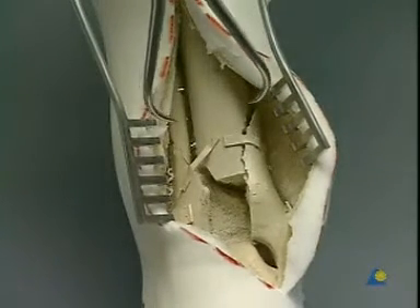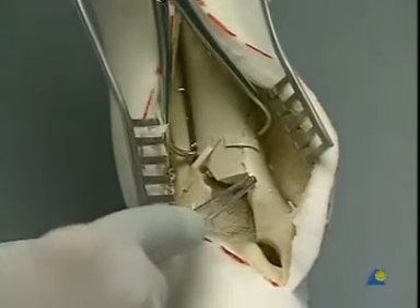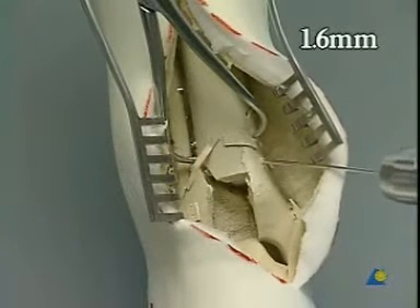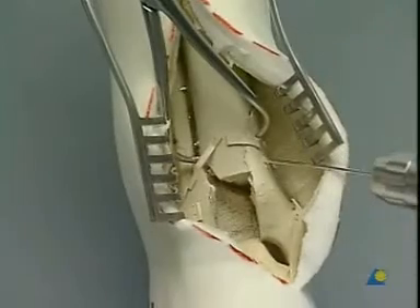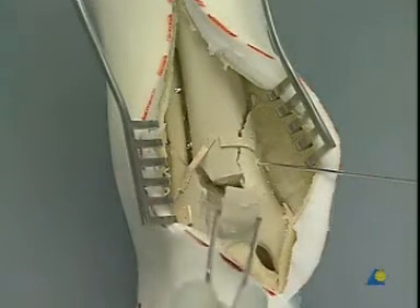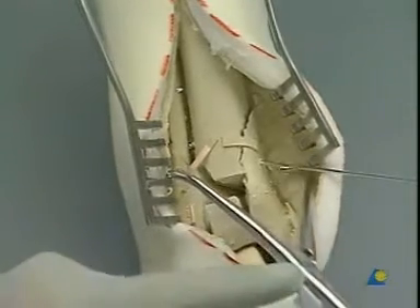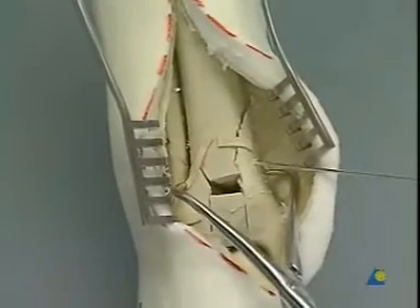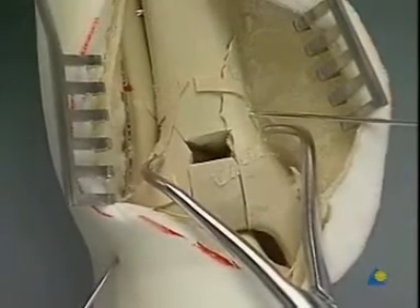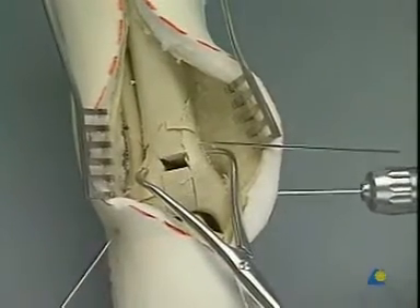We start the reconstruction by reducing the large medial fragment with a pointed reduction forceps or Weber clamp. A 1.6 millimeter K-wire holds the fragments in place. The anterior fragment is put back into place, and again the reduction forceps is used to hold the anterolateral key fragment, while the second K-wire is placed through a stab incision over the tubercule de Chaput. A third K-wire secures the anatomically reduced articular fragments in a transverse direction.